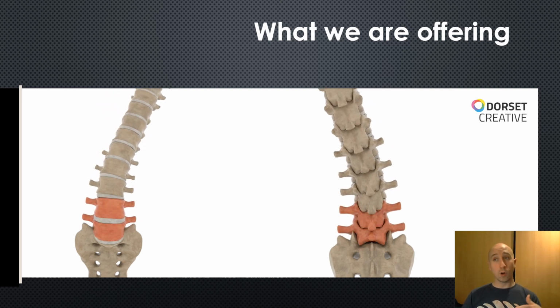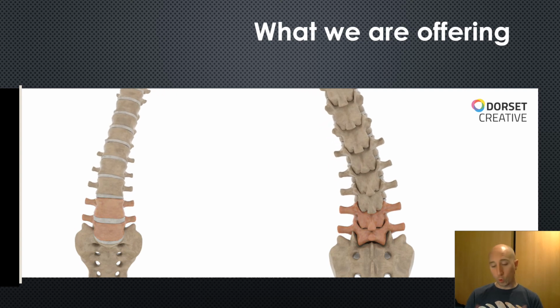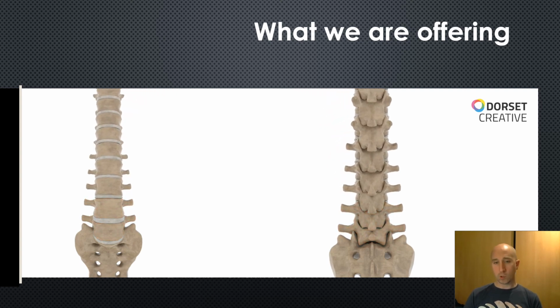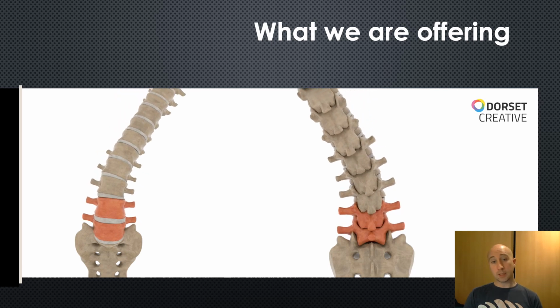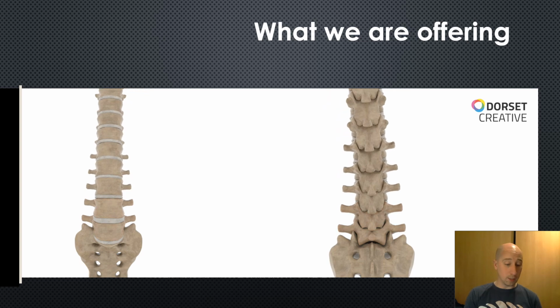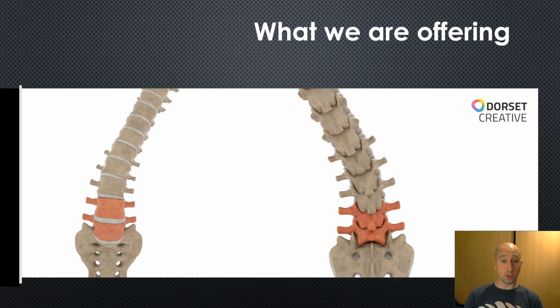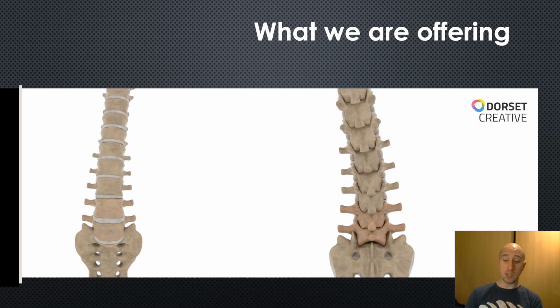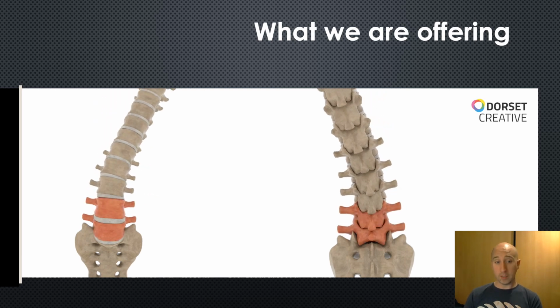So we can not only know what normal mechanics ranges are, what normal mechanics of the spine are, but also how repeatable those mechanics are. And lastly, the images themselves. We've used them to measure the kinematics, but they can be used to drive future research in image recognition. We have identified the position of each vertebra in each image of each sequence.